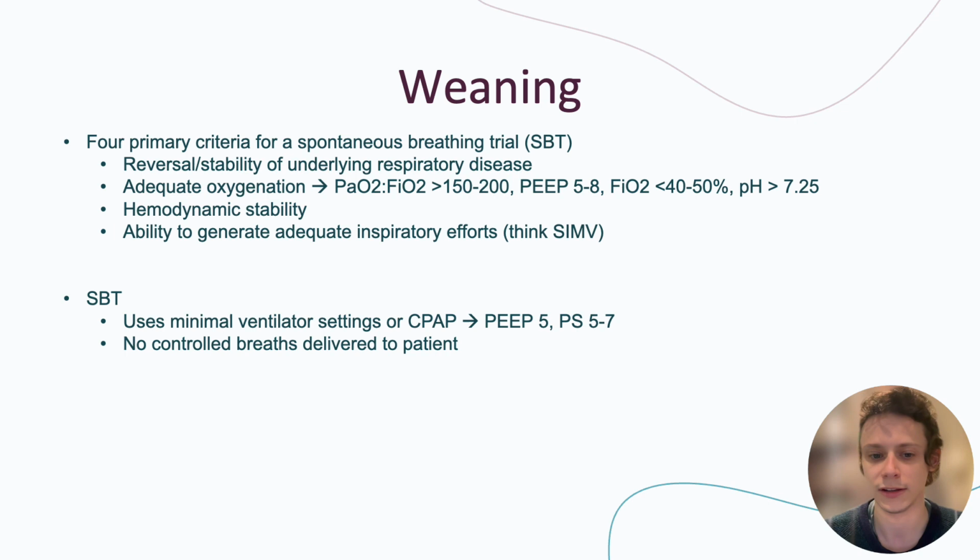They also need to be hemodynamically stable. This does not mean that they can't be on pressors. It just means that their pressor doses have to be small and they are hemodynamically stable, so they're not fluctuating. And then they also have to have the ability to generate adequate inspiratory effort. So once again, think SIMV. That's why SIMV is a good bridge to extubation, because you're able to see that the patient's able to generate their own inspiratory efforts.